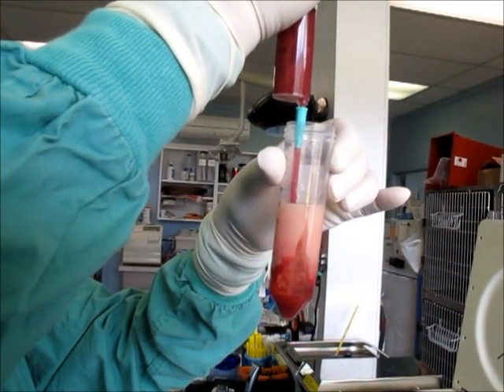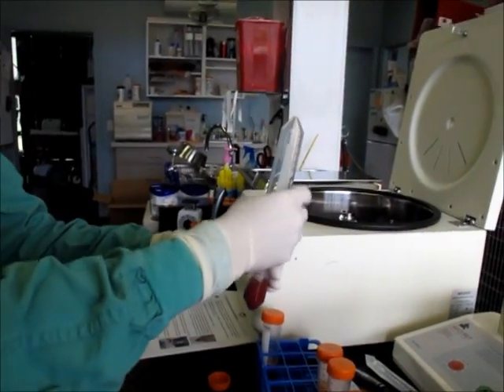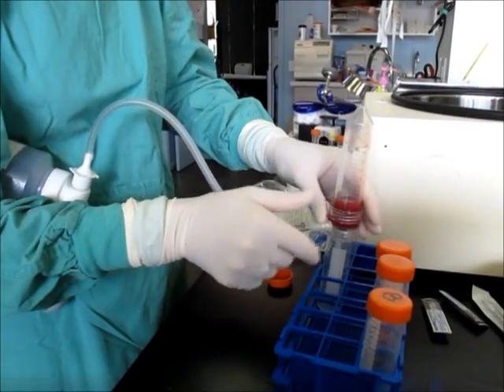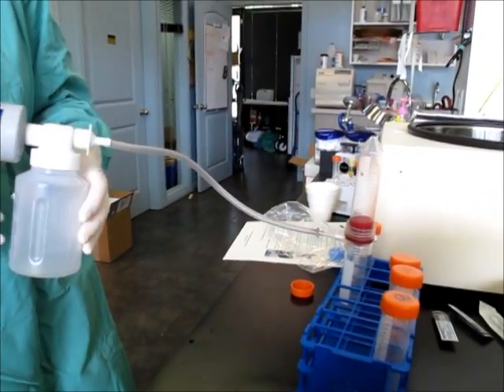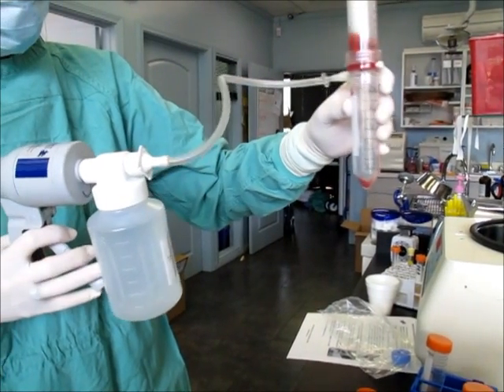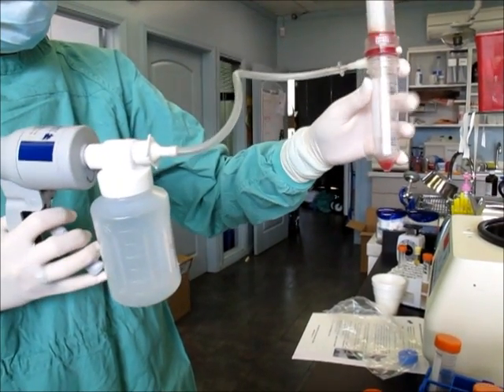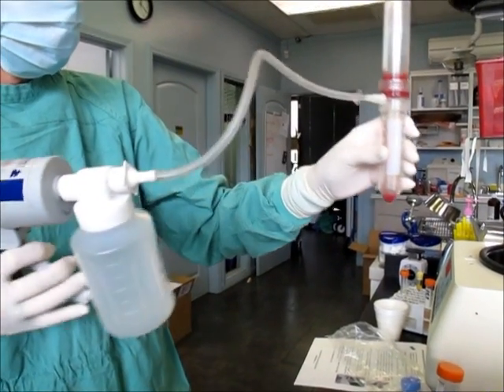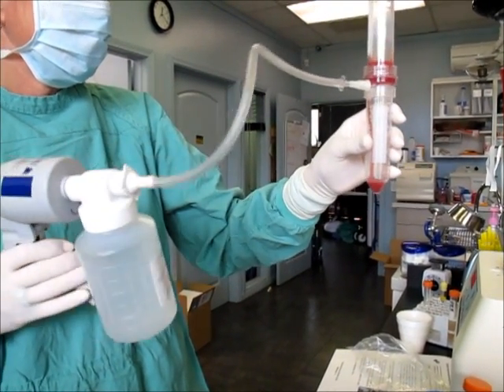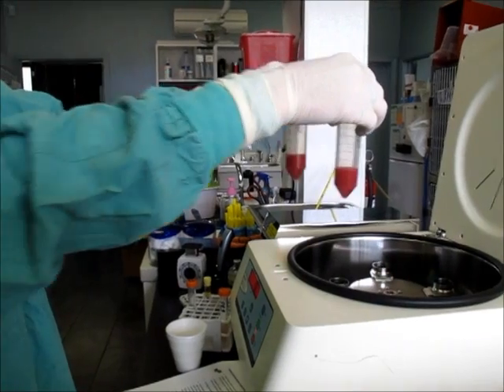We'll stop when the red gets to the beginning of the conical section. This will put a little bit of vacuum on it so we can filter. Now we have isolated the stromal vascular fraction, and we go in for another spin.